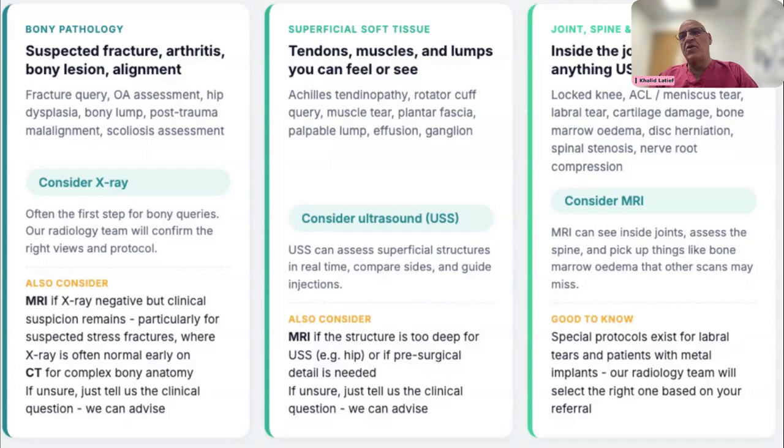We put the needle into the joint space, in the shoulder or the hip. We confirm that we're in the joint with X-ray guidance, or some people do it with ultrasound, but my preference is X-ray guidance. Once we're in the joint space, we confirm it with X-ray contrast, and then we distend the shoulder with some contrast material that the MRI will see. In our practice, we used to use gadolinium in the joint, but nowadays we just inject about 15 milliliters of saline. Once we've done that, we take the needle out, and the patient goes to have an MR arthrogram in the MR scanner.